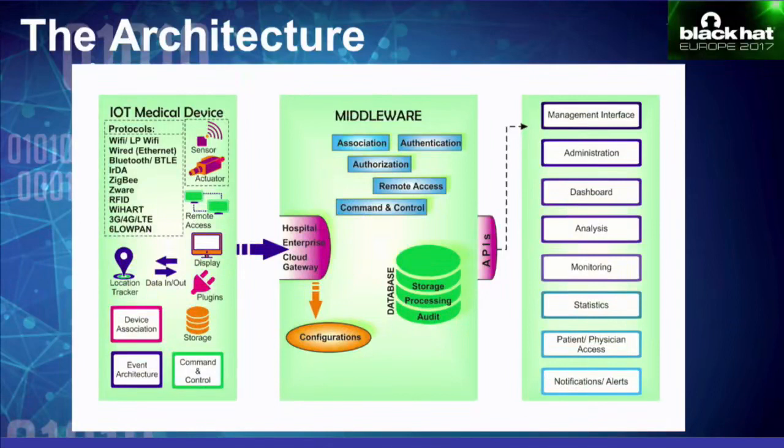It augments the data and then outputs a consumable set of data, which can then be consumed by researchers, medical practitioners, etc. It also exposes a few APIs, application programming interfaces, which can then feed into a web portal where, for example, your physician could log in and gain access to patient data. Researchers could log in for further analysis. Even device manufacturers could log in to gather data about the devices and how they're functioning.